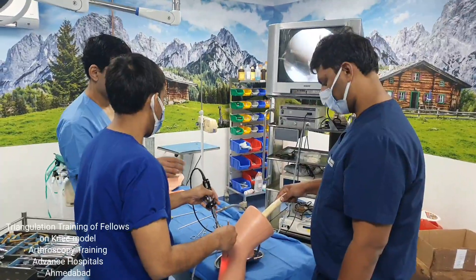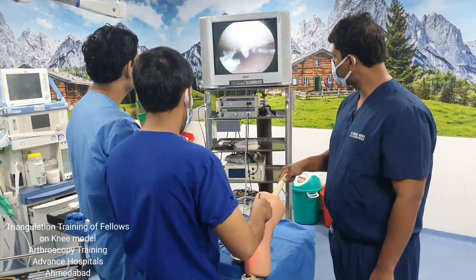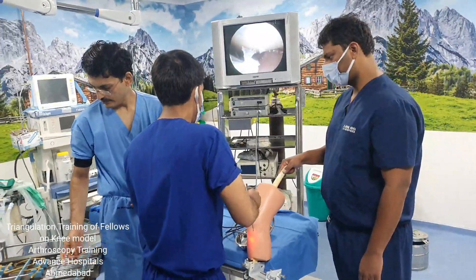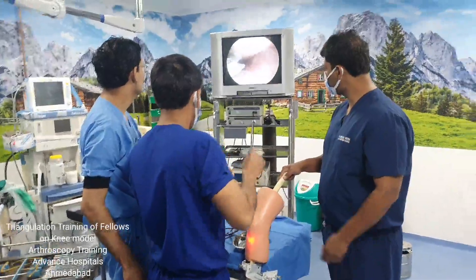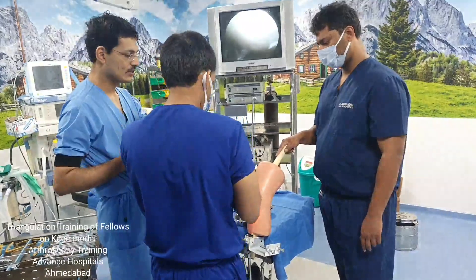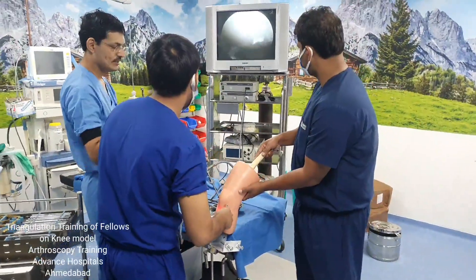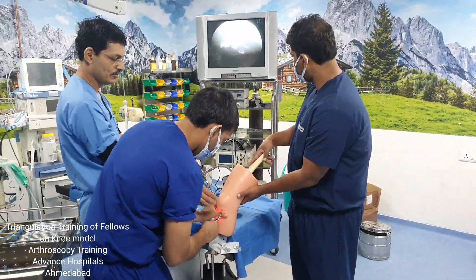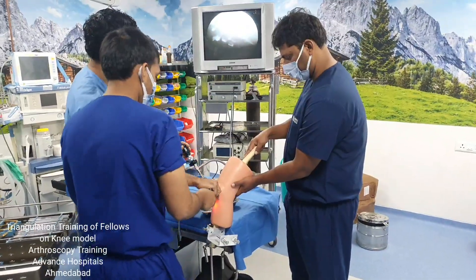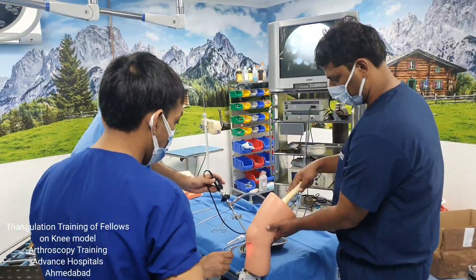Scope adjustment is less, but you need to do more adjustment with your probe. This is the condylar region and you can see these are like loose bodies. If you want to remove these loose bodies, you can use something like a grasper and just remove them from there. You have to be very, very accurate and go in a very precise fashion.